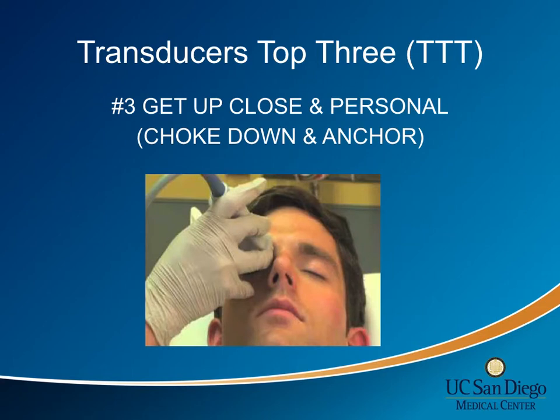3. You will have the best dexterity with the probe if you hold it at the end closest to the patient and use your free fingers or edge of palm to stabilize and anchor your hand. Think of using it exactly how you would use a pen to write on paper.